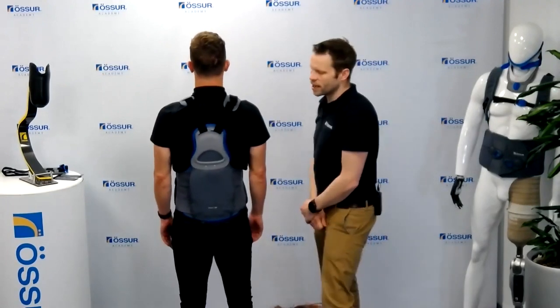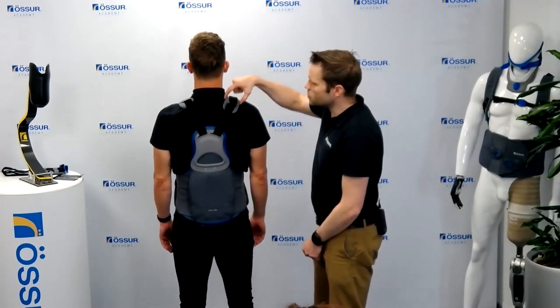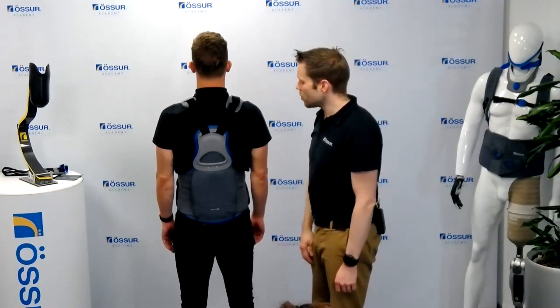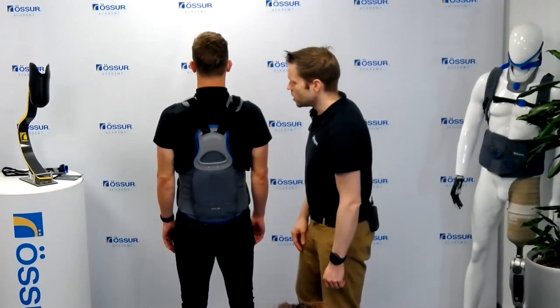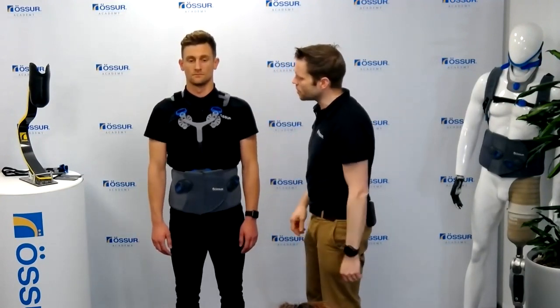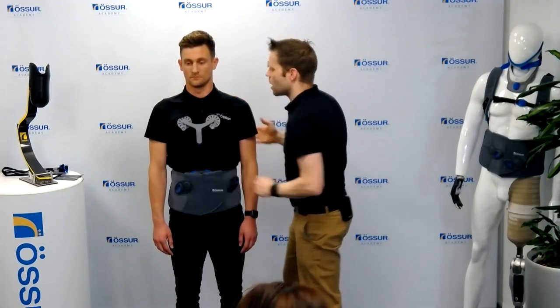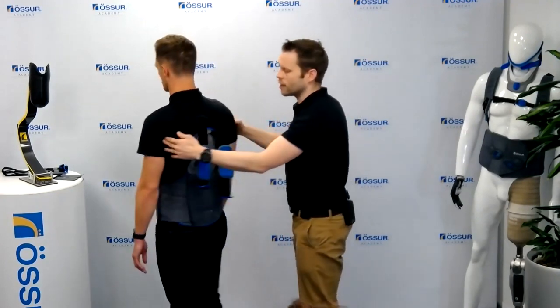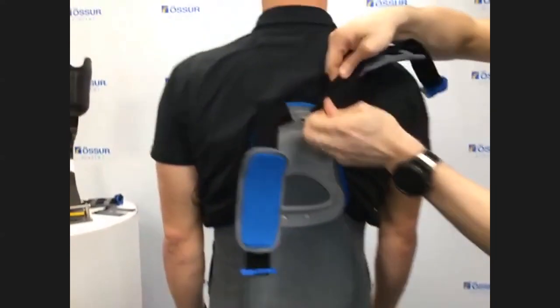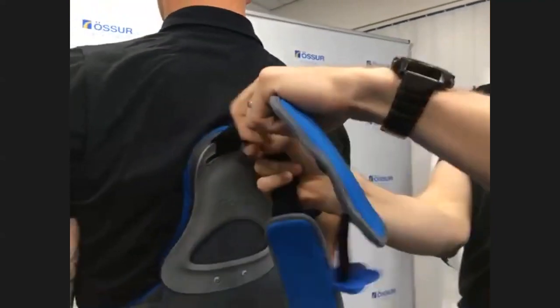Okay, and you can see here again, nice and central. We've adjusted these accordingly either side. These pads can also be adjusted to wherever you would need, so you can adjust those if we need to. Now, going on to the second configuration, utilizing the axilla straps to stabilize the anterior thoracic extension, what we would need to do, and these are included in the kit, is detach these front two and then spin round. So if we go over to the dynamic camera, Izzy's going to come in and show you what I'm doing here. We adjust these and remove those either side.